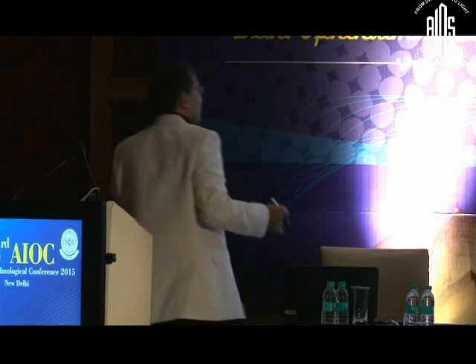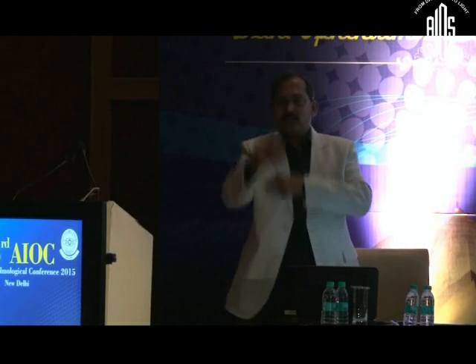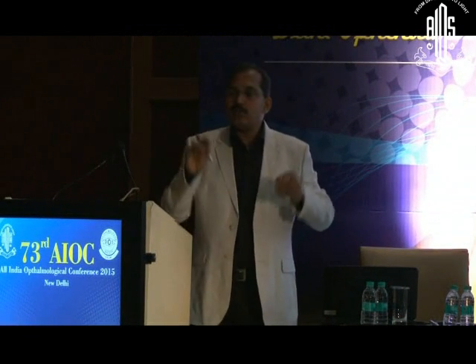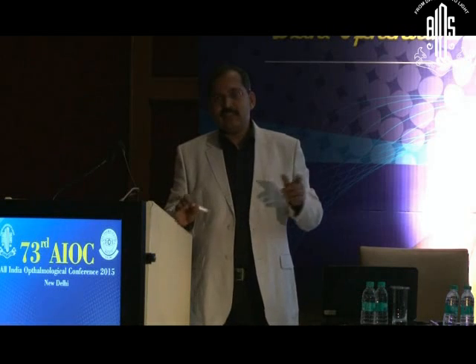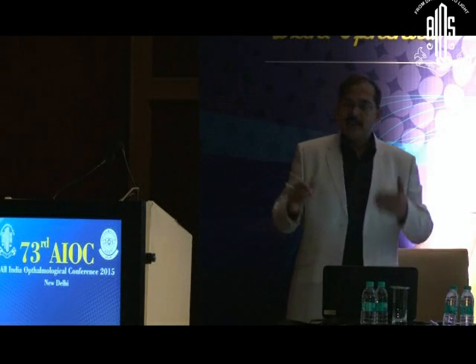So now check this, and what you do is you flip it. Flip it by 180 degrees. That means when you flip it, this becomes plus, this becomes minus. Okay, so position number 1, position number 2. Ask him to compare both and say which one he saw better. The patient says the second time, when the minus cylinder was on this side, he saw better.